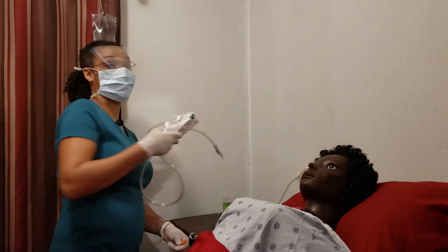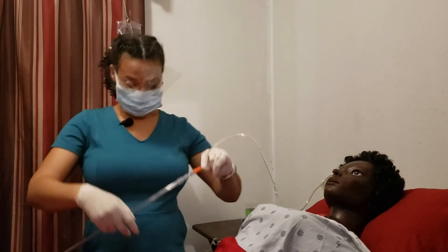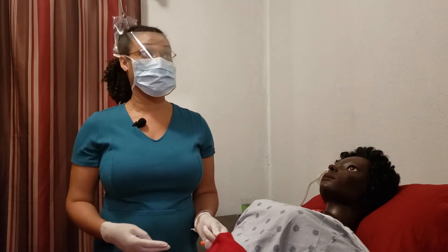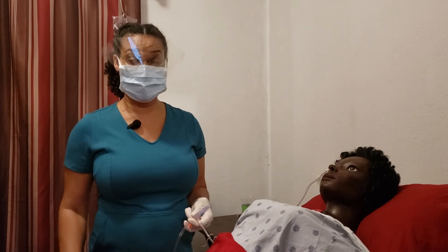In some cases, you would attach a urine bag. The urine bag has a connection that can fit directly onto the tube, so it fits well. You would lower it down so that it gravity feeds into the bag. After you've allowed it to gravity feed, make sure that you keep measuring what's happening, because input and output is very important. You do not want to distend the stomach unnecessarily or lose water to some kind of gastric problem that may have developed from the intake of a chemical. You would repeat that procedure as many times as necessary, and please be aware of I&O — intake and output.